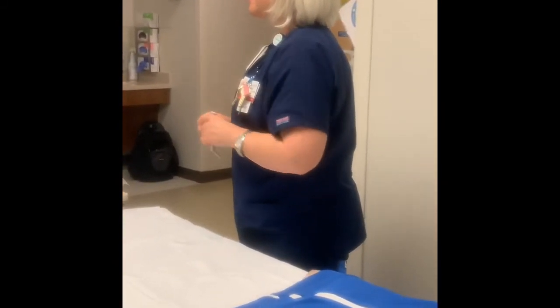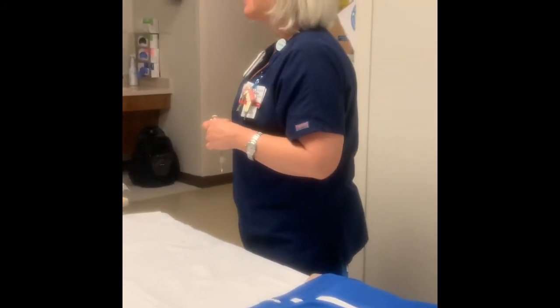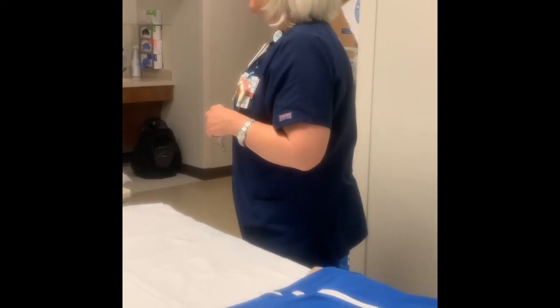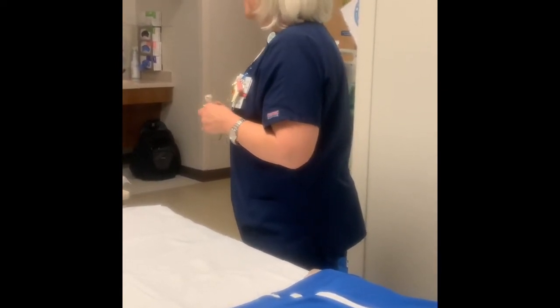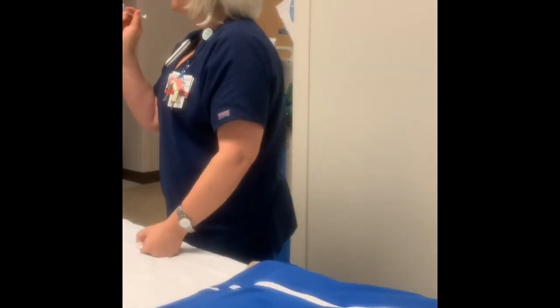Make sure and assess their breathing. They're breathing okay. See if there's something obstructing. I would probably clean it, would be my instinct to clean it. Okay. Anybody else? So we got our obturator.